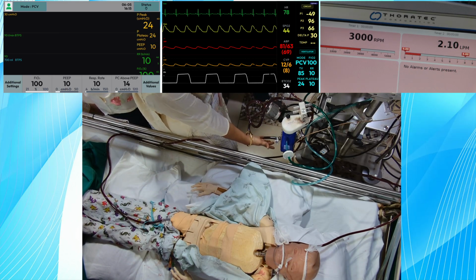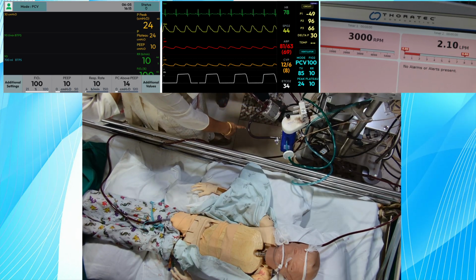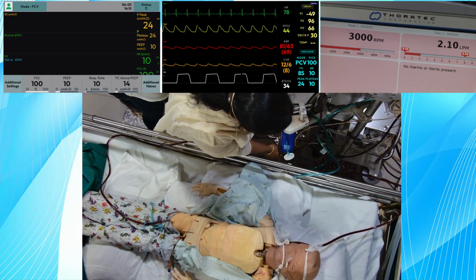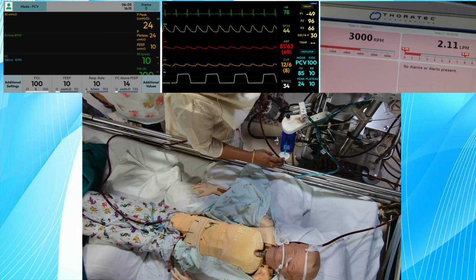Now the problem will be with the oxygenator only. Wrong. There must be readings. Change the oxygenator. Wait, the connections are correct only. Is anything else remaining? Outlet, this is the drainage. Wrong connections here can also lead to this. You want to change the oxygenator directly? No, sir, no.